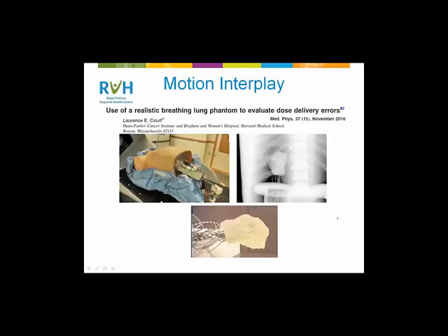And then they used a control system here to actually realize that in practice. Then what they did is they loaded up this tumor with 20 microdosimeters. And they carried out an entire course of fractionated radiotherapy to this phantom and accumulated dose in the dosimeters and compared the dose after each fraction to the dose that the treatment planning computer thought had accumulated to that point in the treatment. Then they did this for a number of different treatment planning techniques to see the effect of the treatment planning technique on our ability to deliver dose accurately in the tumor. Okay?